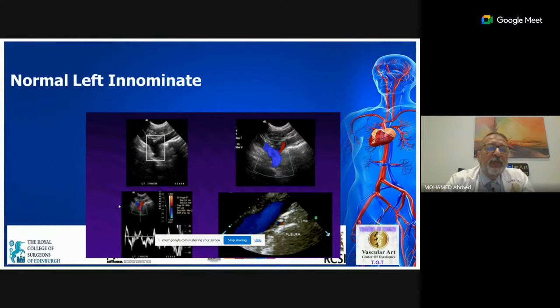And believe me, you are the one who sees the patient, and if you ask for the duplex, you have the clinical question in your mind. I remember a lot of radiologists, when they get a request to do Doppler, come and ask me, what does the clinician want from this? For example, if you have just done a radiocephalic shunt and you want a duplex the next day, what is the information you're looking for?